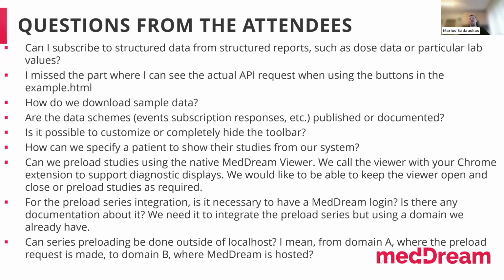Yes, yes. If your system runs on a different address, it's possible to do this. That's why you need this post message whitelist parameter. You would list from where MedDream accepts these requests, API calls.